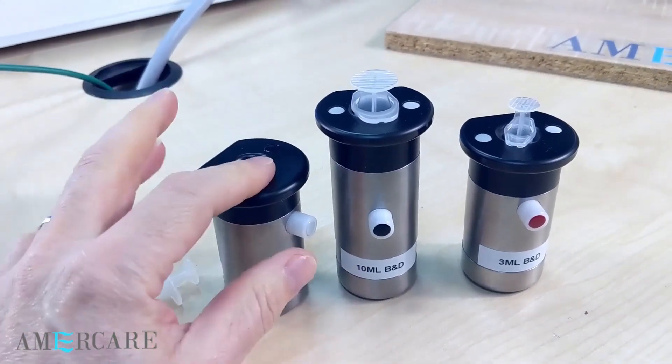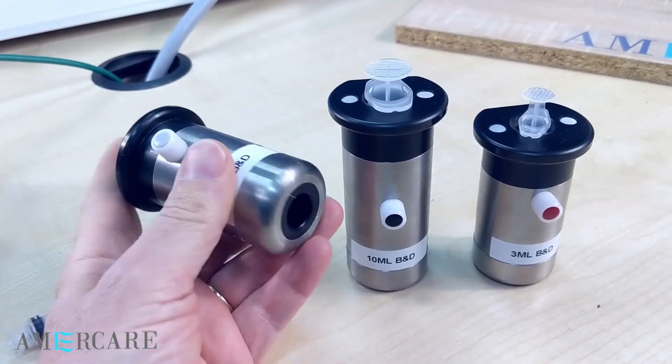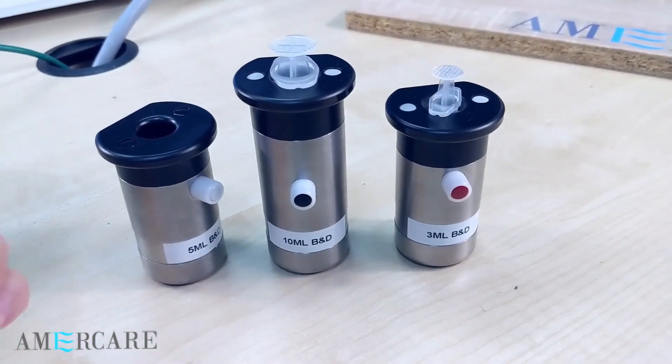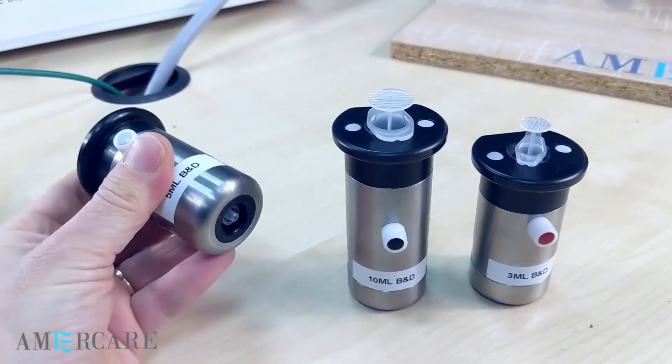The syringe shield consists of two parts: the plastic upper and the tungsten body with a 9mm wall thickness. The design ensures that the syringe is held centrally and is sized to the correct length of the body.